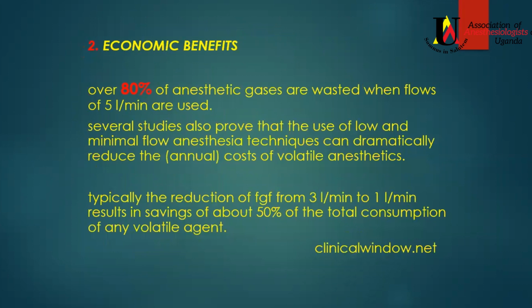Let's look at the economic benefits. Anesthetic gases are wasted when flows of 5 liters per minute are used. Basically, you are just venting everything out. This not only wastes, but also most of your colleagues may leave the theatre when they are a bit saturated with some gas. Okay. Several studies also prove that the use of low flow and minimal flow anesthesia techniques can dramatically reduce the annual cost of volatile anesthetics.